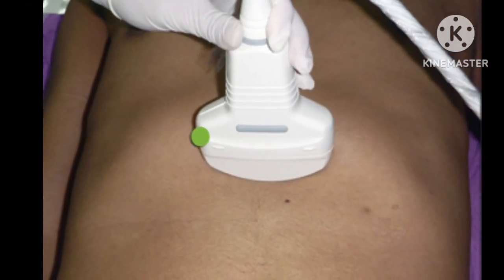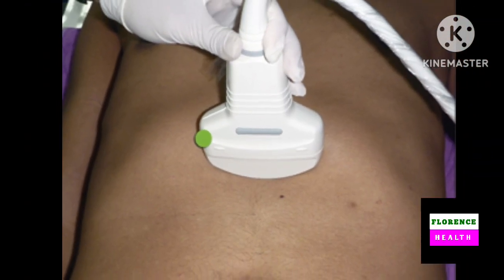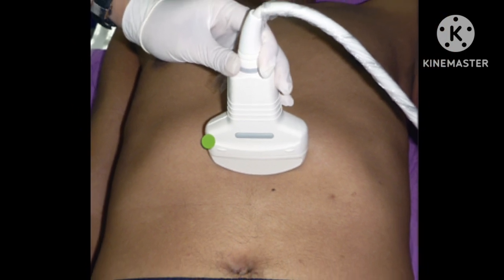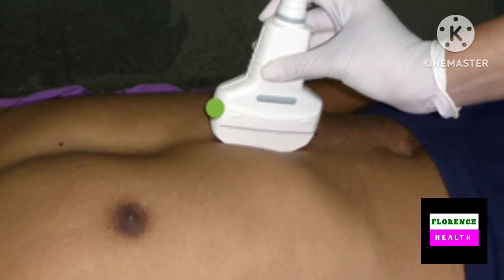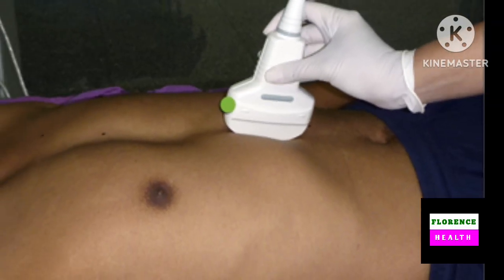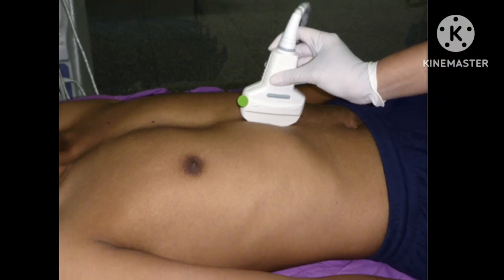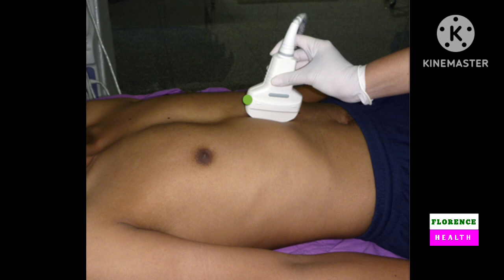Let's do it with an example. The slide shows the sonologist taking a transverse section of an organ as the indicator is towards the right side of the body. This slide shows the sonologist taking a longitudinal section of an organ as the probe marker is towards the patient's head.